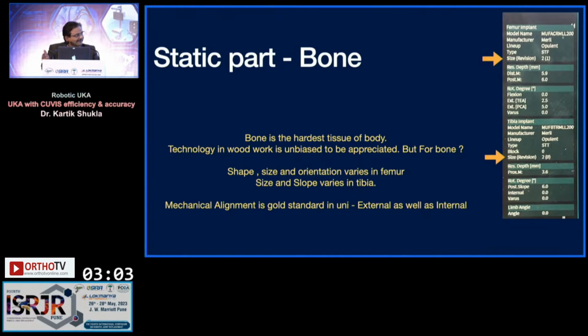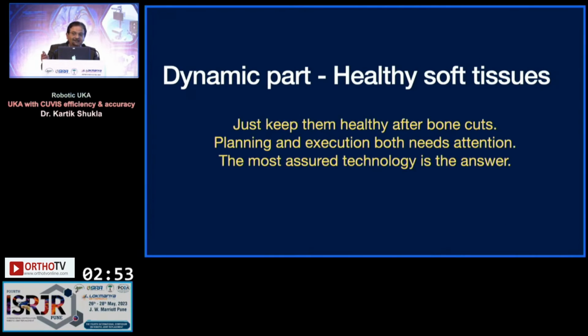See, it is just like booking your flight. You don't want to move here and there on the table and struggle. I think this is one of the finest ways. You plan everything before you get scrubbed. And the dynamic part, which is the already healthy soft tissues.